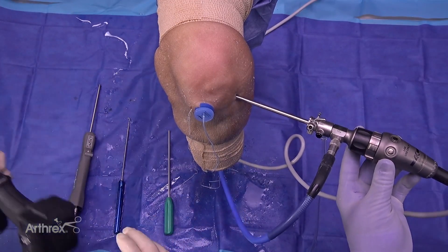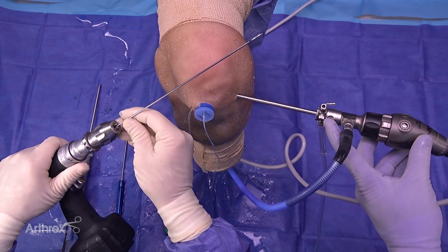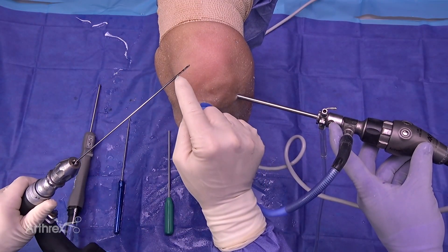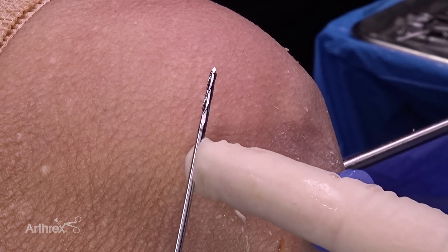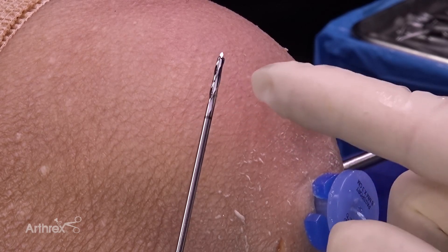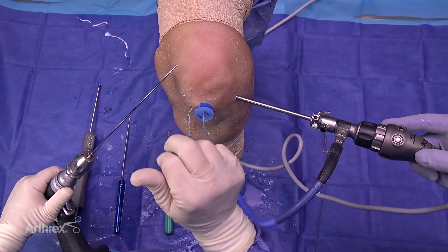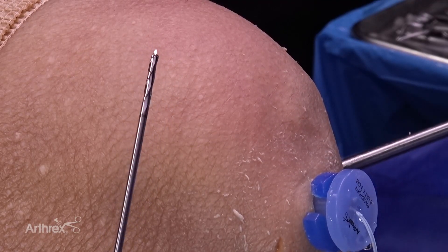The next order of business is to place our first anchor. We've got our cannulated 2.4 drill pin. There's a nice laser mark right at the tip so when you chuck it up you're right at the laser mark and know you're going to the appropriate depth. At the distal end of the 2.4 cannulated drill there's also a laser mark to confirm how deep you're going. Make sure the cannulation pin tip is fully protruding from the drill by seating it with the knurled end down at the base — that ensures the sharp end is out to begin your drill hole.